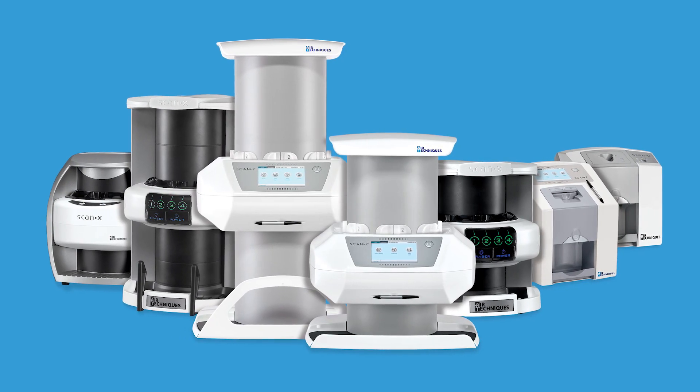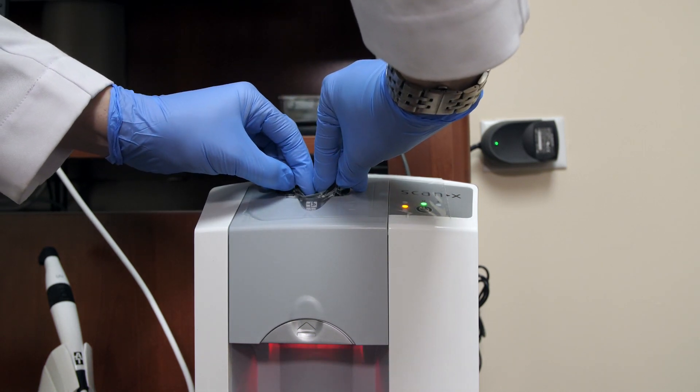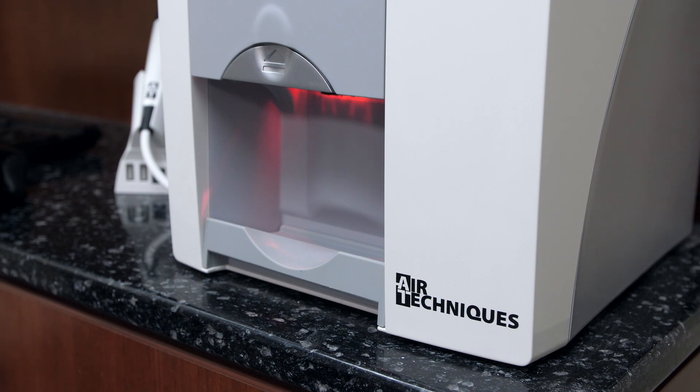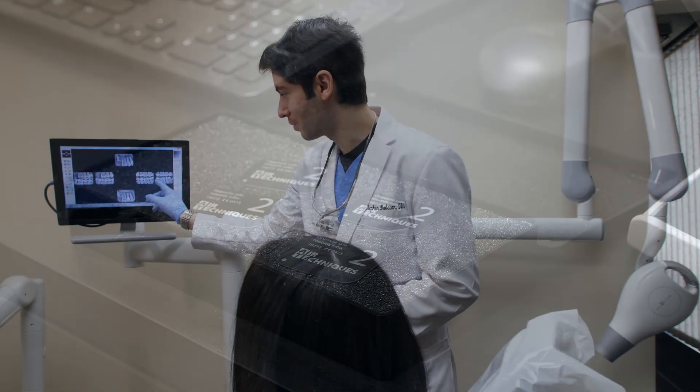Air Techniques has several models available, depending on the size of your practice and your imaging needs. This ranges from a single to a four-track solution. The return on investment with the ScanX has been great. Our workflow has increased, and we've seen an enhancement in the overall patient treatment abilities. The machine has required little maintenance, and the phosphor plates are wireless, durable, and they last a long time.